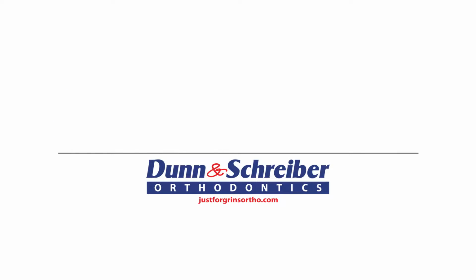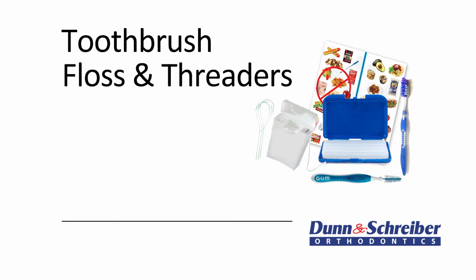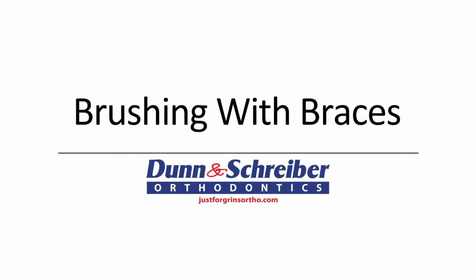So now that your braces are on, let's review your home care kit, which includes a few things to help you take care of your braces. There's a toothbrush, floss and floss threaders, a proxy brush, wax, a food list, and a hygiene guide card. Okay, now down to business.